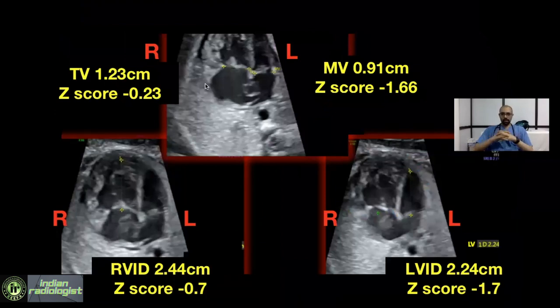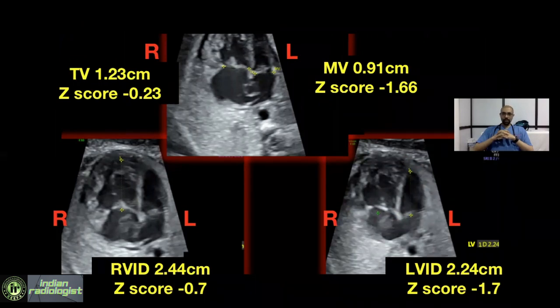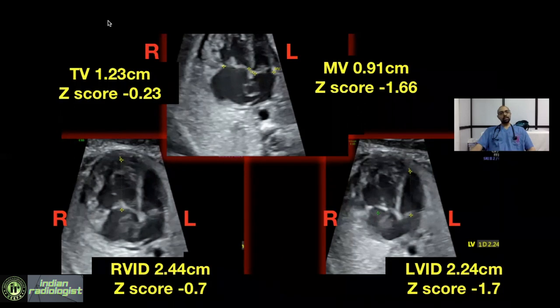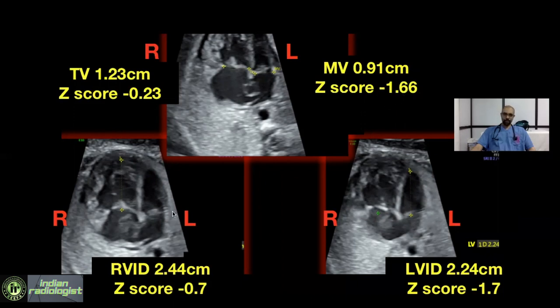This again is a four-chamber view where we have compared the mitral valve annulus and the tricuspid valve annulus. The tricuspid valve annulus Z-score is minus 0.23, whereas the mitral valve is smaller with a Z-score of minus 1.66. The RV internal diameter has a Z-score of minus 0.7, whereas the LV internal diameter is even smaller with a Z-score of minus 1.7.